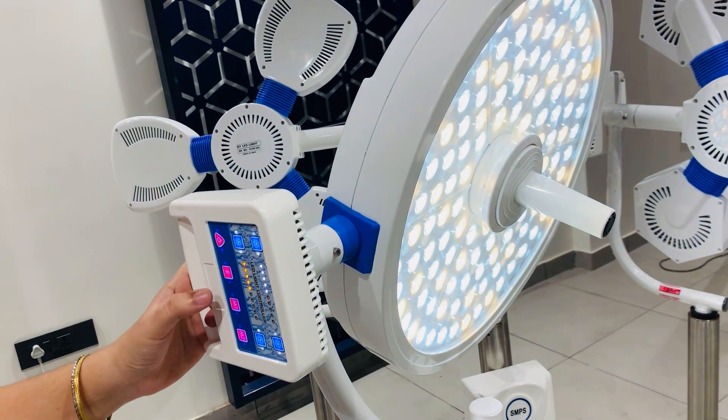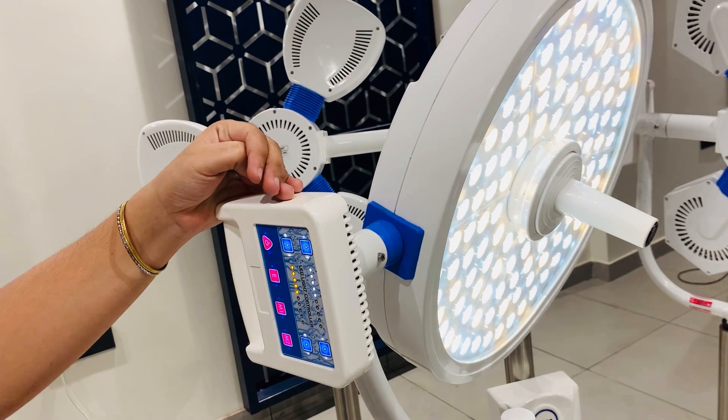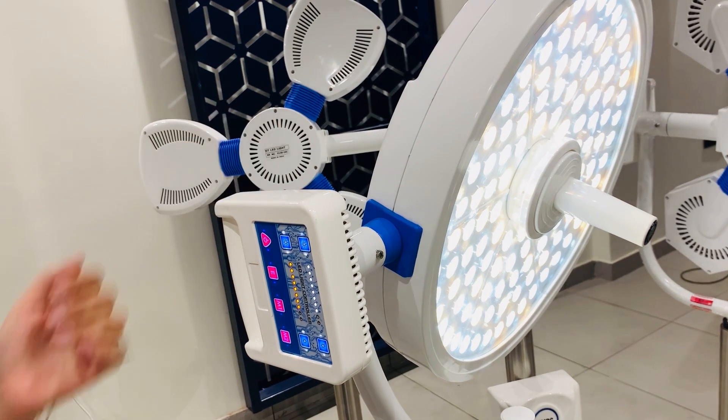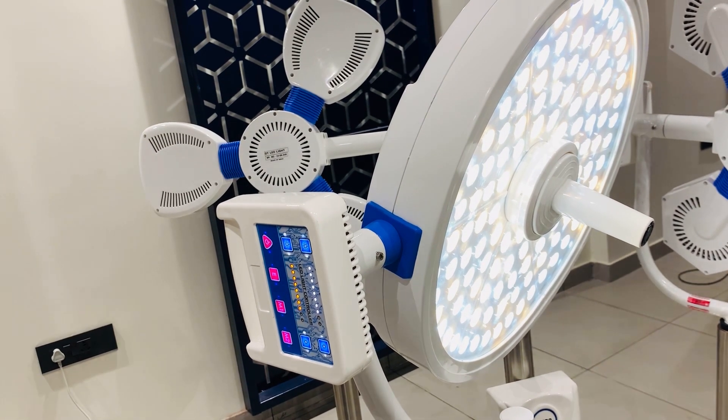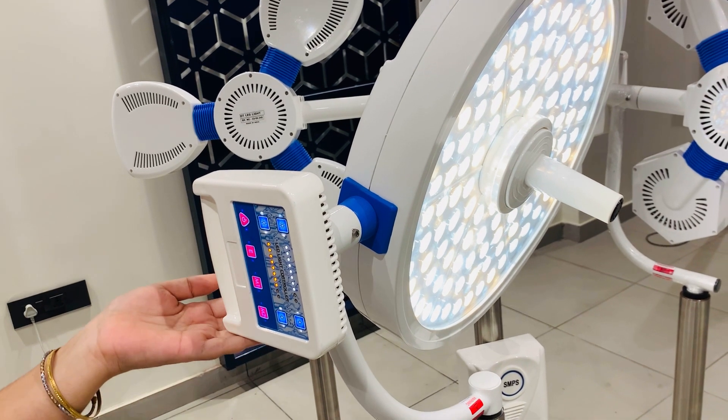With the Memory 1 function, the white light and the yellow light come on at 50-50%. With the Memory 2 function, the white light and the yellow light come on at 75-75%. This touch controller is really easy to access.